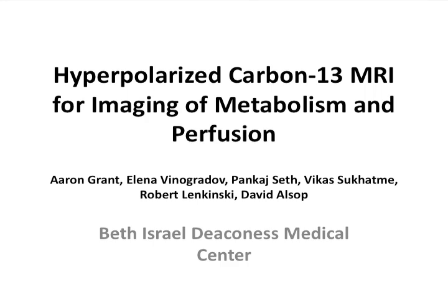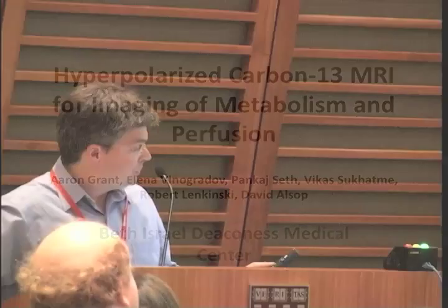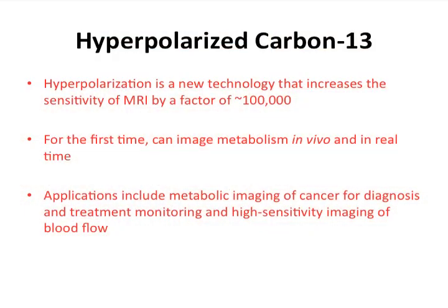So good morning. I'm going to be talking about some work we've been doing with hyperpolarization, particularly hyperpolarized carbon-13. Hyperpolarization generically refers to any technology where you prepare a bolus of a contrast agent, which might be a liquid or a gas, in a state of very high nuclear magnetization using an instrument generically referred to as a hyperpolarizer. We're going to hear a little bit later about hyperpolarized gases like helium or xenon that are used for imaging the air spaces of the lungs.